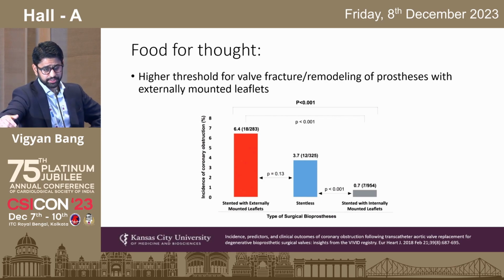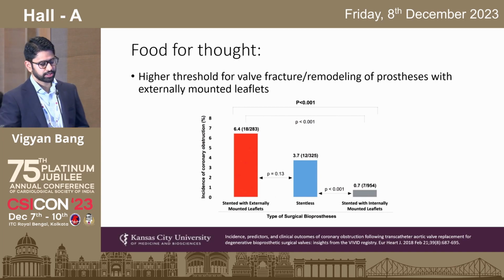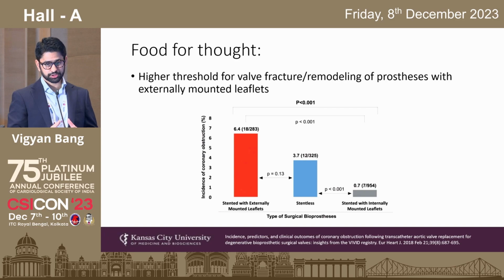And he did fine. The impeller came out the next day. He went home. He continues to do well. But at some point, perfection is the enemy of good. And I've always wondered whether, in trying to optimize gradients for valve-in-valve TAVR, we trade the risk for potential and life-threatening complications. And this is from the VIVID registry, where the risk for coronary obstruction is highest in those patients with externally mounted leaflets.